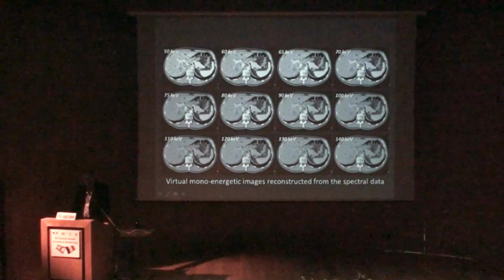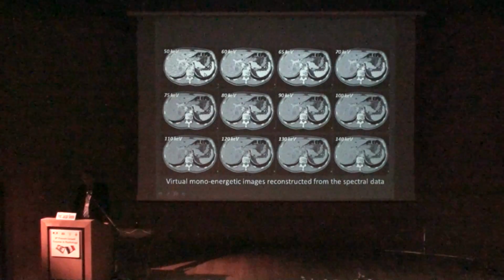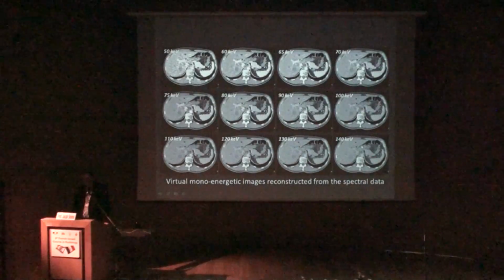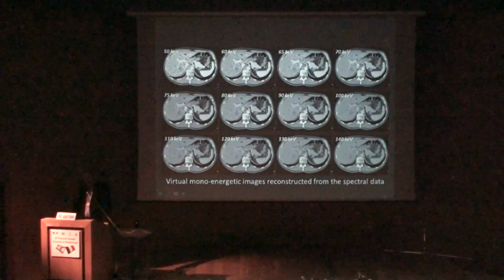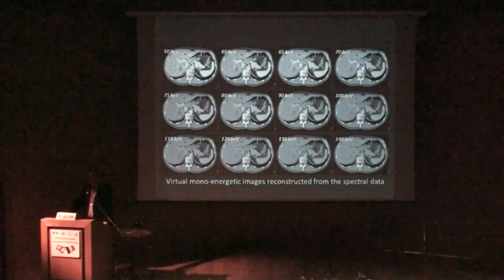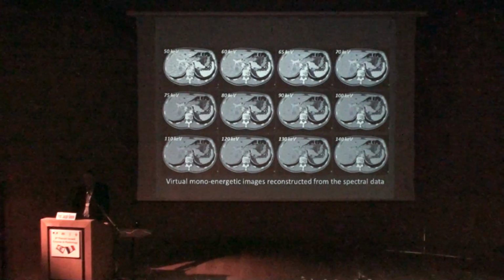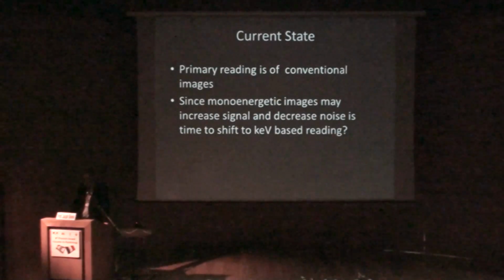slice. So we can see the portal vein, we can see the pancreas, we can see the vein with higher attenuation. And when we go up, we see less attenuation, and we see probably less artifact. So instead of calling it regular windowing, as we are used to say in regular CT, we have spectral windowing, enabling us to see different elements when we change and scroll in with different KEVs.